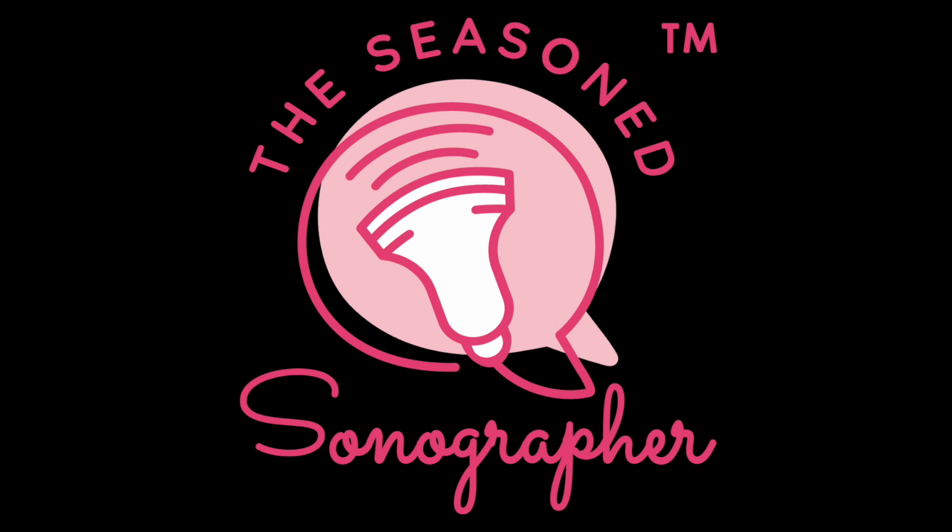So again, if you can't find that pregnancy, try harder. Adjust your depth, adjust your focus and gain. Make a big effort to find it. If the quantitative HCG is in the thousands, it's in there. You need to make a big effort to find it. Adjust that depth. Make sure you're seeing that fundus of the uterus and looking inside that uterus.